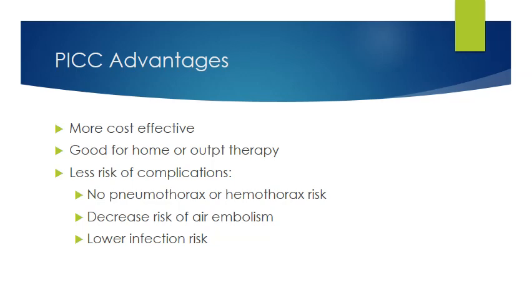Also, an advantage would be it's more cost effective, and we've mentioned this before, that's good for home or outpatient IV therapy, and medications that we could use because it is considered a central line: TPN, chemotherapy, hyperosmolar solutions, irritants. So all of those medications that we couldn't put through the peripheral, we can put through a PICC, and all central lines, we could put those.